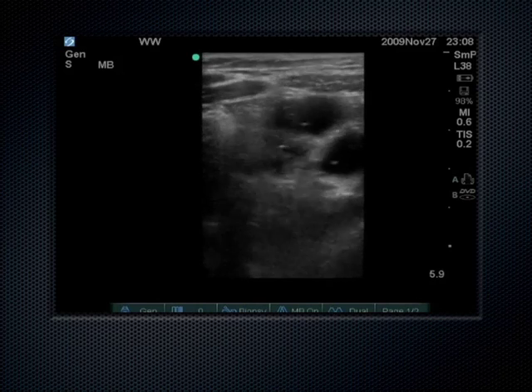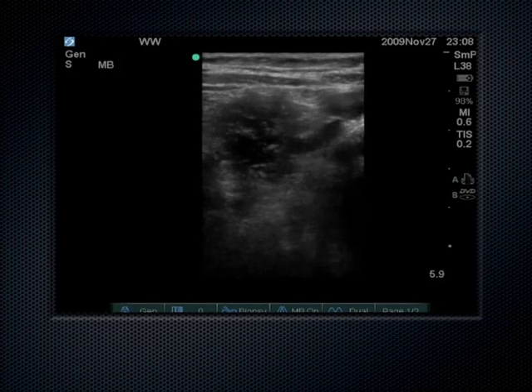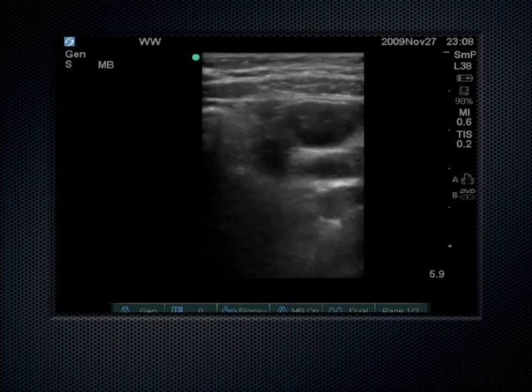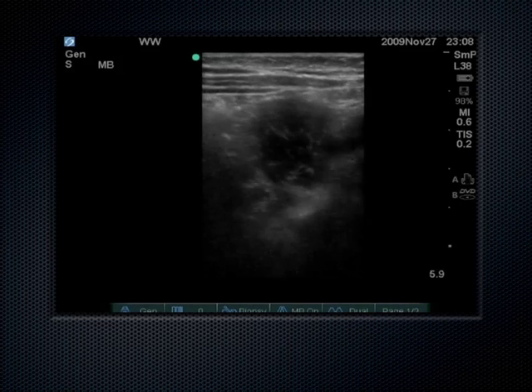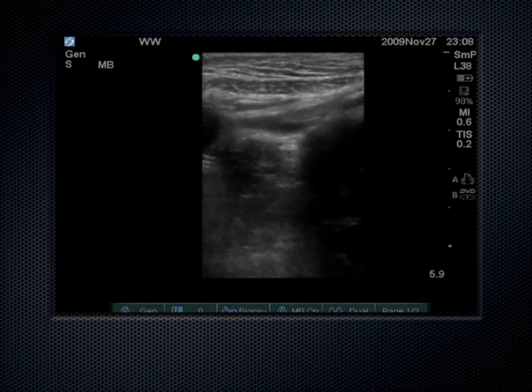Now, if you have appendicitis, all these areas down here in the peritoneal cavity get inflamed. So, it's very painful to be compressing these things. This is the peritoneal lining right here. I can see that peritoneal lining very easily on ultrasound. Everything down here is all intestines, and there's psoas muscle coming all the way up and coming in contact with the abdominal wall musculature.